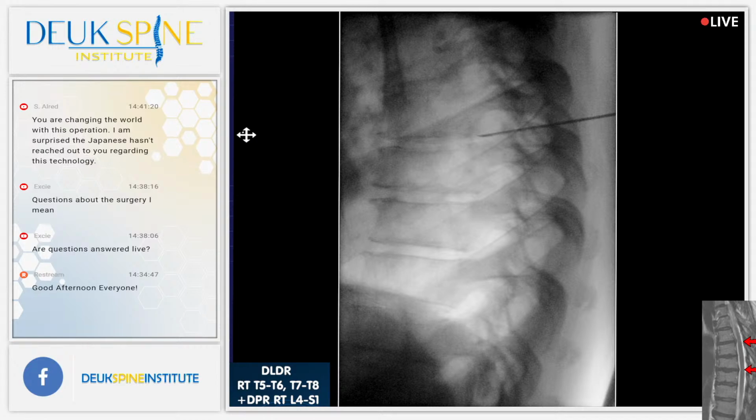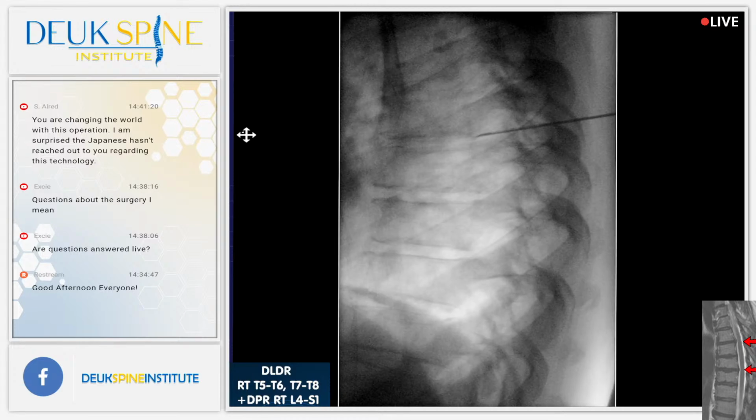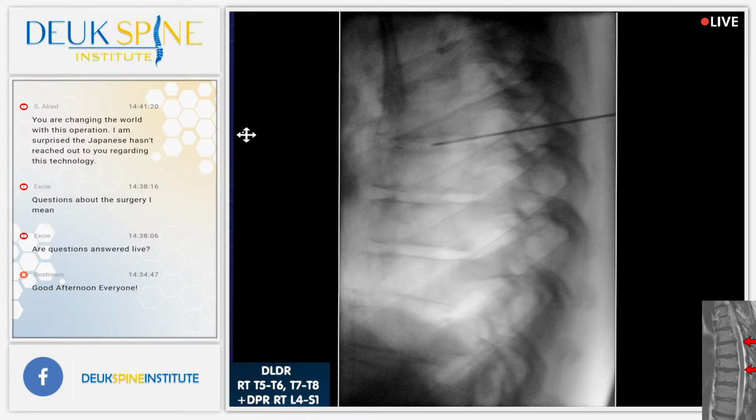Right at the spot. Yeah, don't move, okay? So it's lined up perfectly. You can see I've changed the angle of my needle to head downwards, but this is really quite perfect. Sorry, it's a bit uncomfortable. But guess what? We're in our first bad disc. Great news, success. Okay?